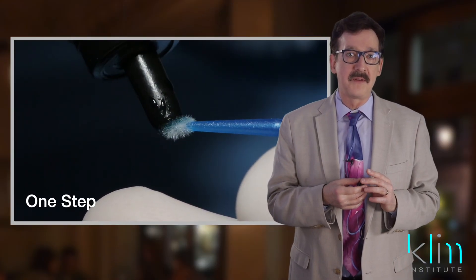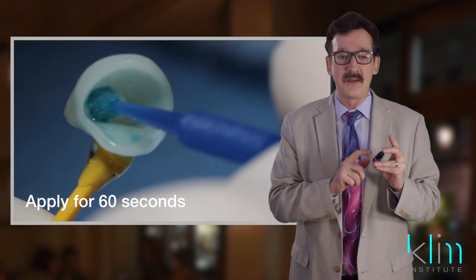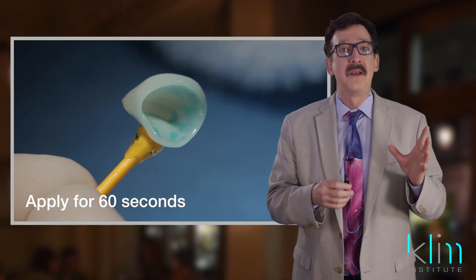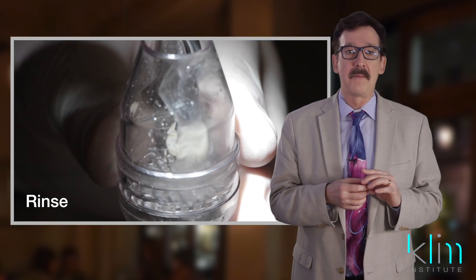With hydrofluoric etch on a lithium disilicate ceramic, you don't want to go below or above 20 seconds, otherwise you lose the optimal bond strength for that ceramic. So take a look at this if you haven't used it yet — it should be in your arsenal to make sure your ceramics are conditioned properly.